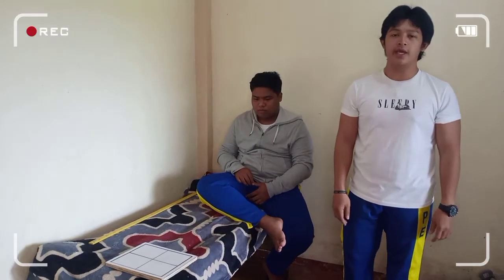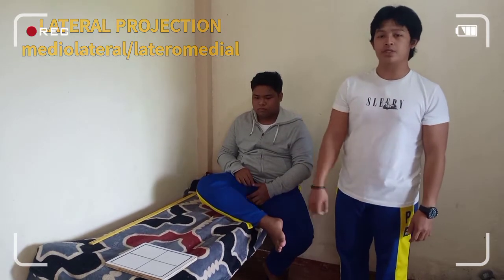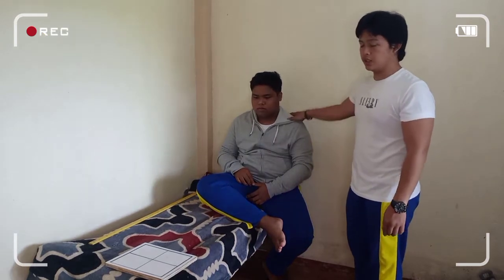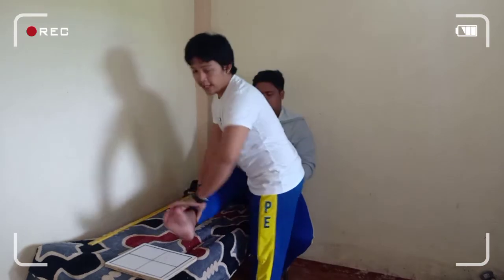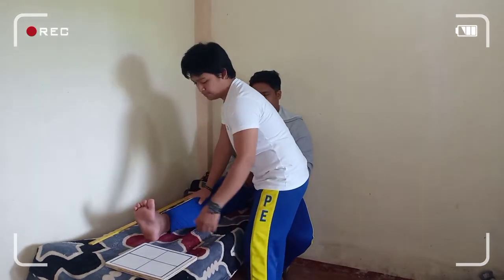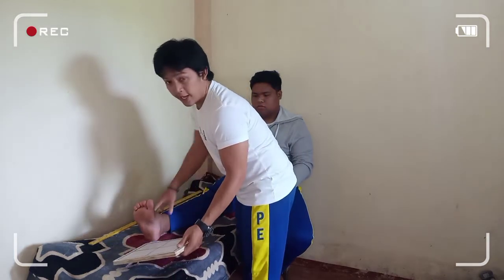The third projection of the ankle is the lateral projection, mediolateral and lateromedial. Have the patient seated or in supine position on the radiographic table and fully extend the knee. Place the image receptor to the ankle.